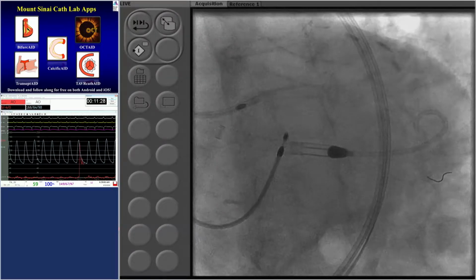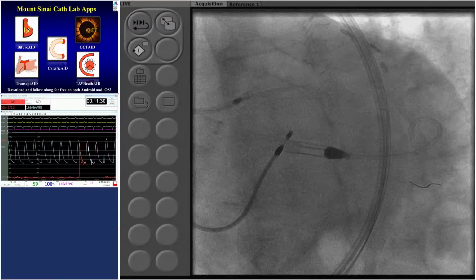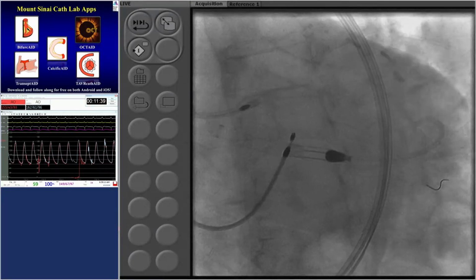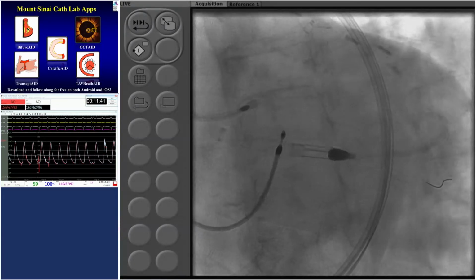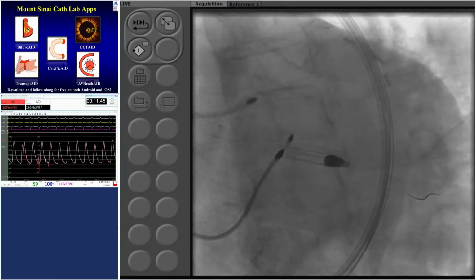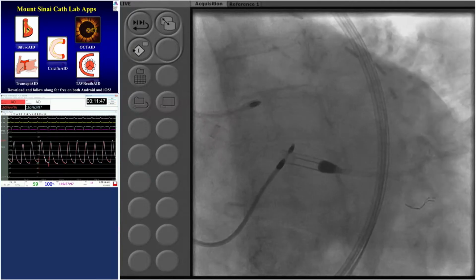Okay, yes. Roxana, a quick question. Pedro, do you pre-close? Yes, absolutely. I do the same TAVR approach with 2 pre-closes on the 9 French to start with. So same, it's 3 steps. We are doing a Dynaglide tap, which is good, and let's start the Rota now. Good. Yep. We're ready to start here.